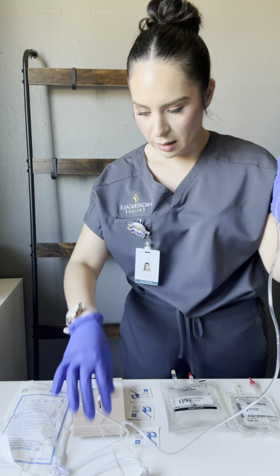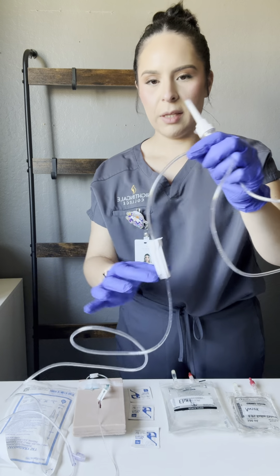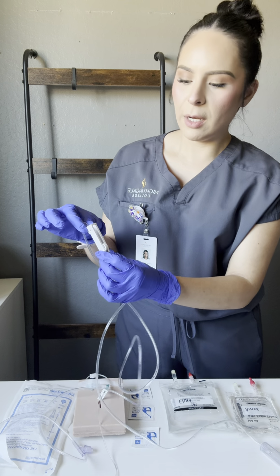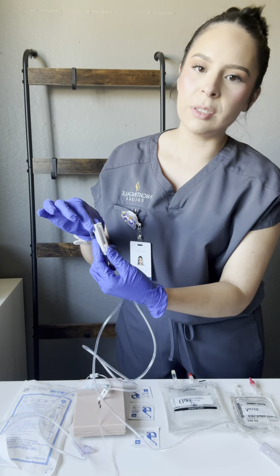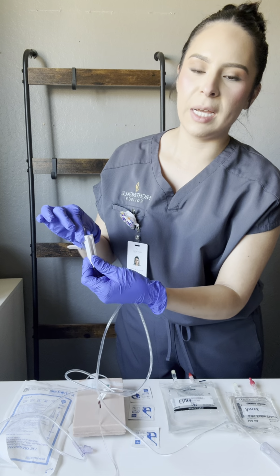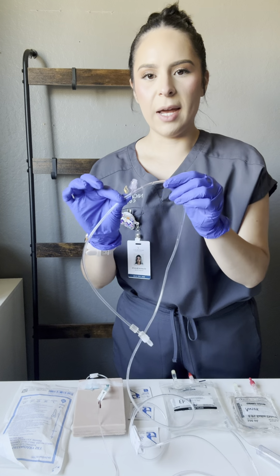Next we have this part here that's called a roller clamp. This helps us adjust the rate of our flow. If it's rolled all the way down, our line is closed, and we can slowly open it by rolling the clamp up, and then close it by rolling the clamp down. Next, we have our Y site.